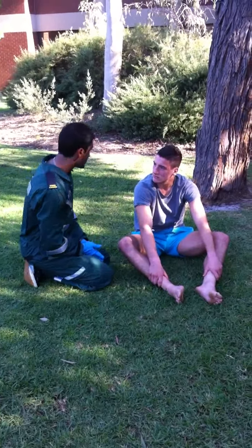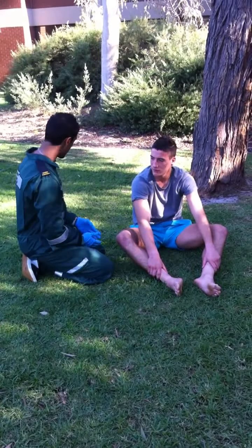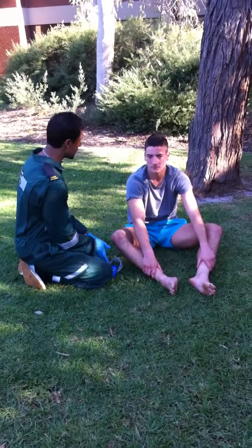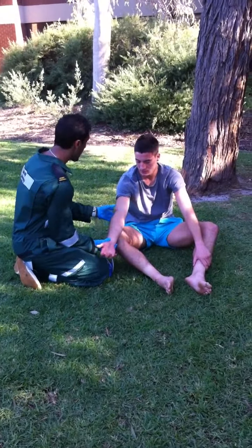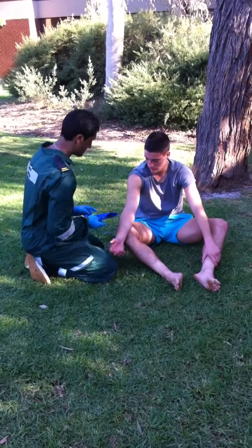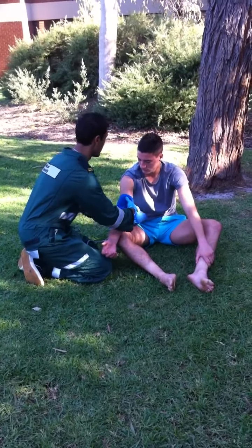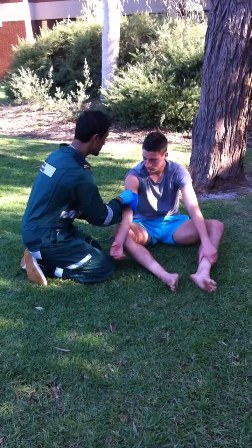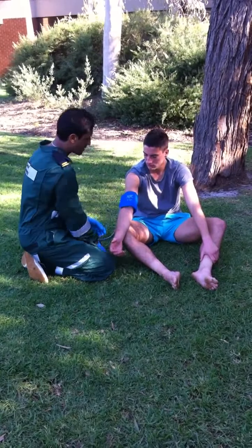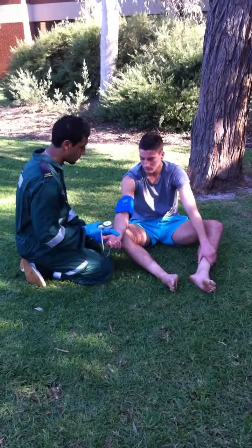Alright, Mr. Jones, I'm just going to take your blood pressure if that's okay. Have you had your blood pressure taken before? Yes, I have. Could you just extend your arm out to me? Just relax it. And is it alright if I move your sleeve up? So I'm just going to place the cuff around your upper arm. You'll feel a slight tightening sensation, and I'm just going to place my fingers on your wrist again if that's okay. And it will tighten up soon.